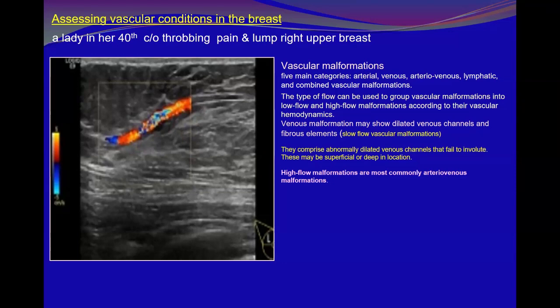Okay, you can see there is a blue color, which is the lowest flow velocity here in this vessel. Near the blue is almost red to orange, and faint green. And even this color is also faintly visualized. And when you go from blue to red, this is increasing blood flow, increasing flow velocity.